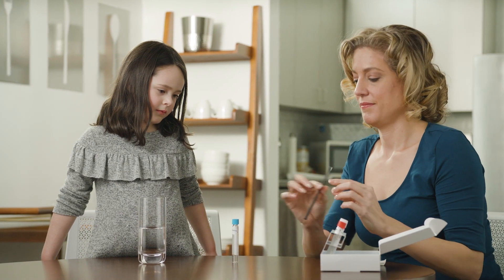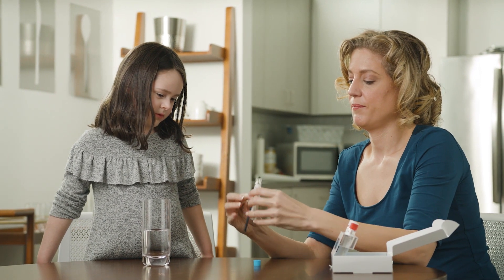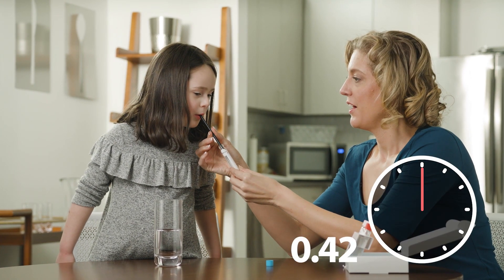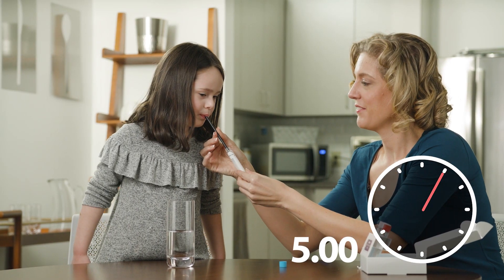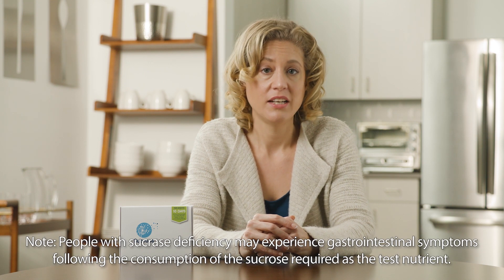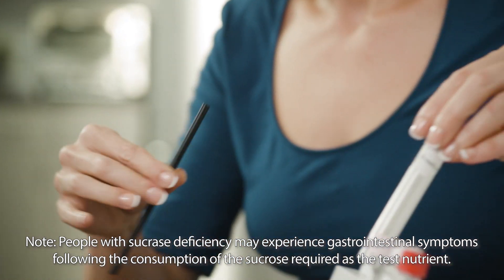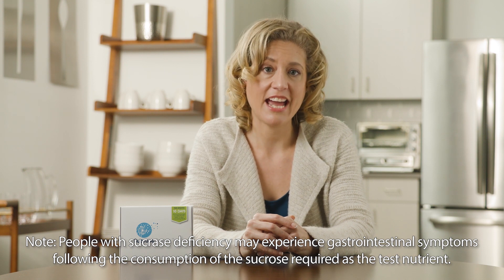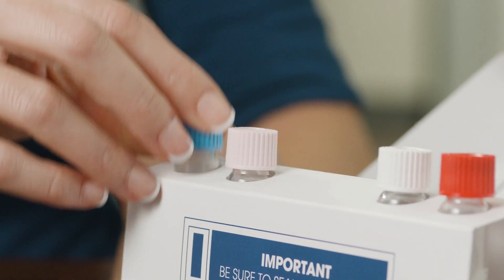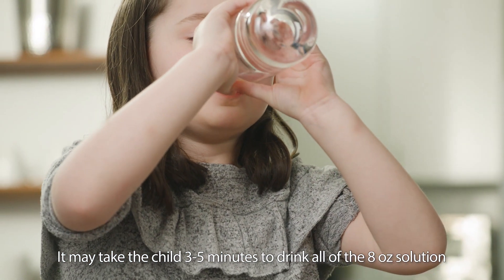Take the first test tube labeled baseline out of the kit and remove the cap. Unwrap the collection straw and insert it halfway into the test tube. Blow through the straw into the test tube for 3 to 5 seconds until you see condensation build up on the walls of the tube. Be sure to breathe normally prior to blowing through the straw — do not inhale deeply. Quickly cap the test tube, securing it tightly. If you cannot replace the cap on the tube within 5 seconds, start the breath collection again and cap the tube. Place the tube back into its slot. Drink all of the sucrose solution that you prepared earlier immediately upon completion of the baseline tube.